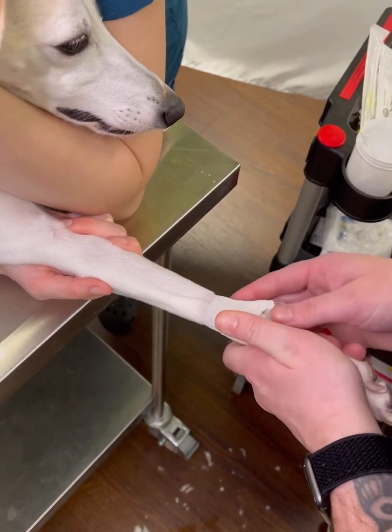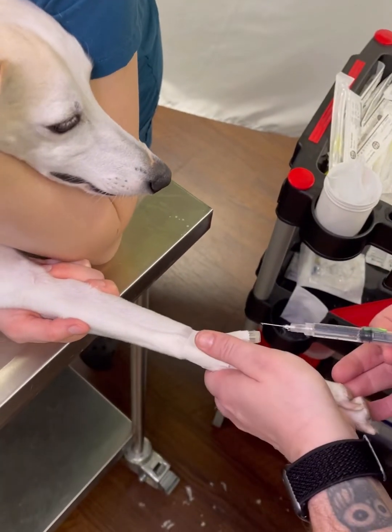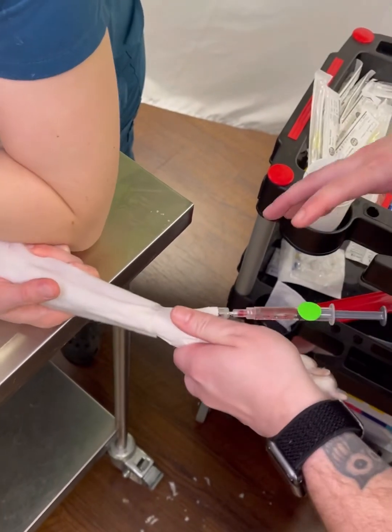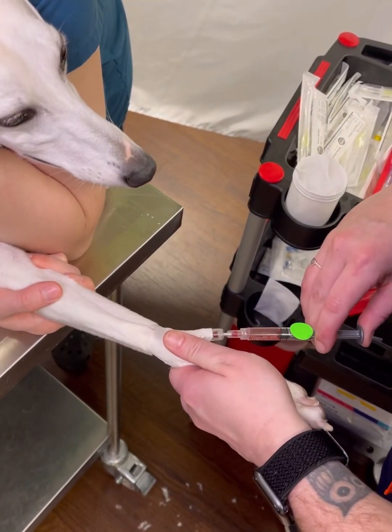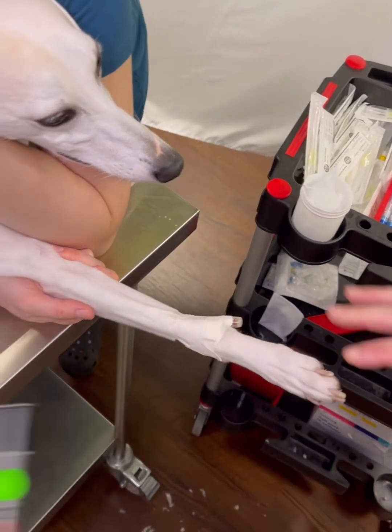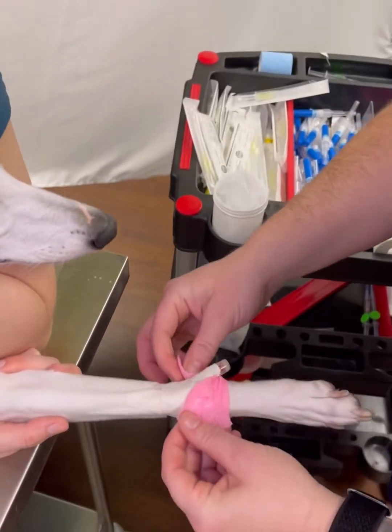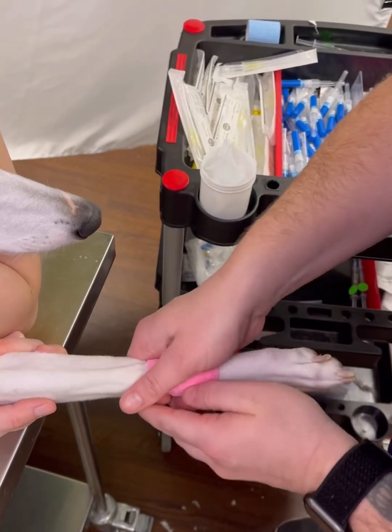Now you're ready to flush to make sure your catheter is in. You're going to grab your flush, put it in your cap, drop back a little bit to make sure you get blood. Madison's going to put her thumb over the vein, and I'm going to pulse the flush into the vein. Make sure it's in — she'll confirm, I can confirm. Your last piece is going to be a piece of vet wrap. You'll rip a notch in it, it will go underneath your catheter and wrap it around. Give it a good squeeze, and you're done.